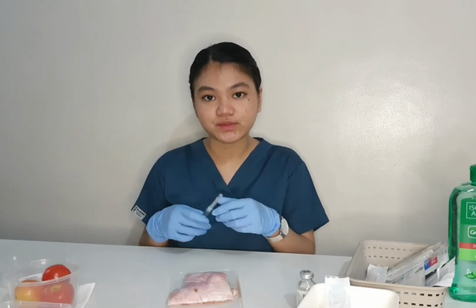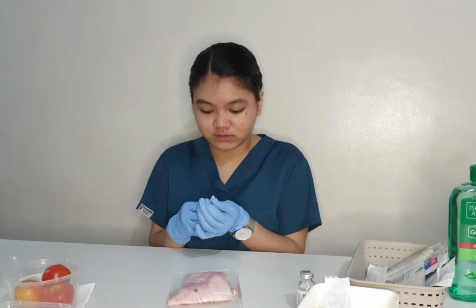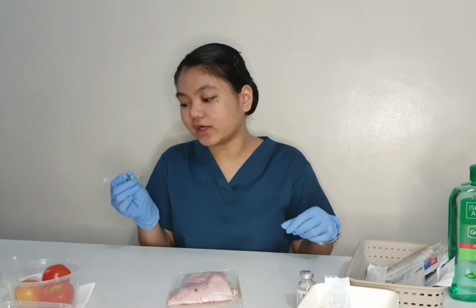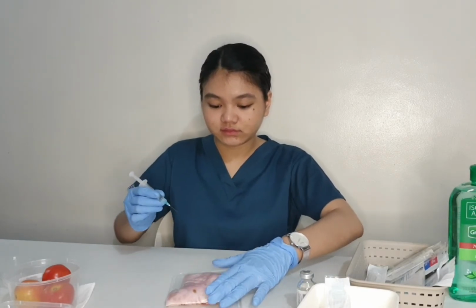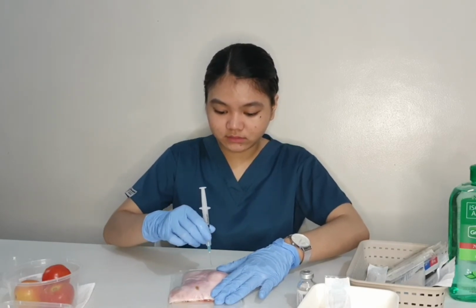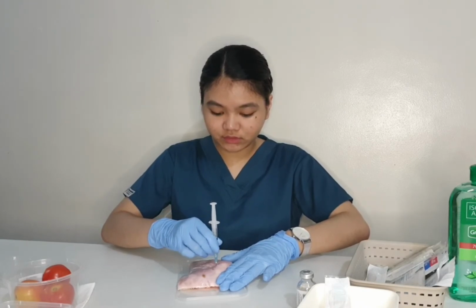The last one that I will be showing to you is the intramuscular injection. Let's remove the cover, the cap of the needle. And upon injecting the medication, we must hold the syringe like a pen and inject it to the patient with a 90-degree angle. Okay, so let's now do it. 90-degree angle. Here you go.